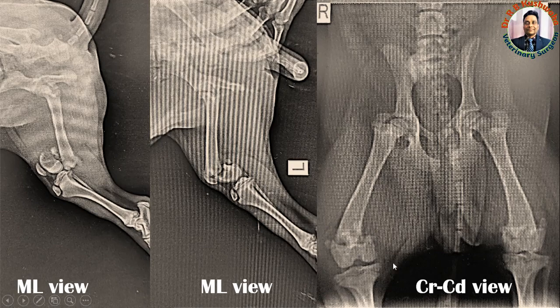The craniocaudal deviation in this particular view is basically superimposed, so here we can see only the lateral and medial deviation. In this particular fracture there is no lateral or medial deviation — it is only craniocaudal deviation. That is why in the craniocaudal view it appears, particularly for the left side, almost normal — but it is not.